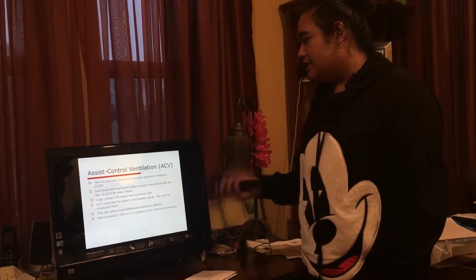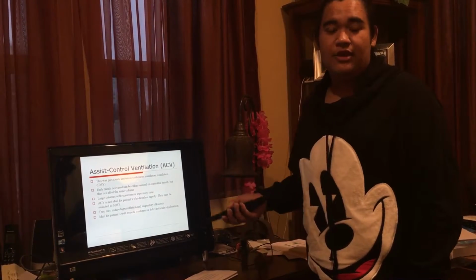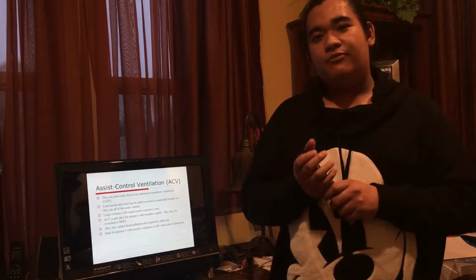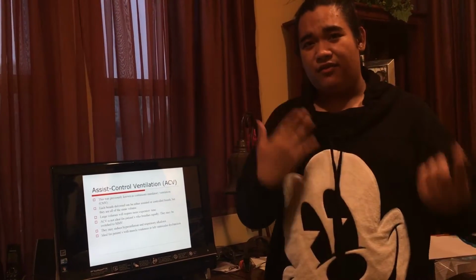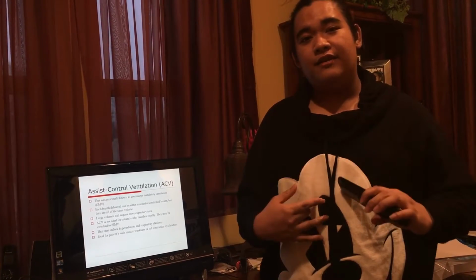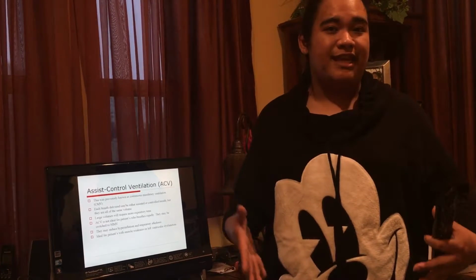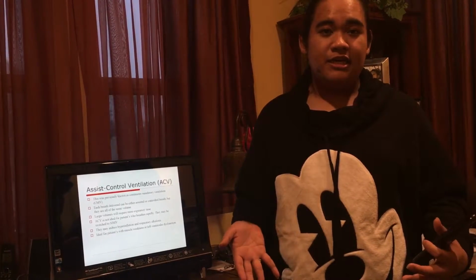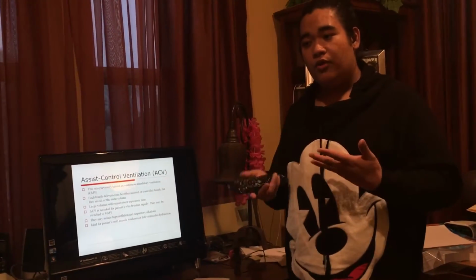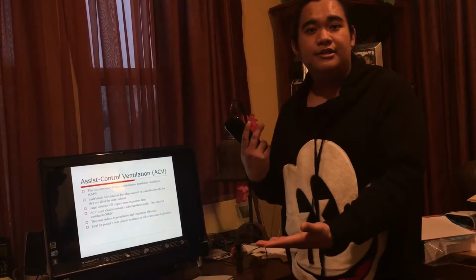If we're giving larger volumes, we need to have more expiratory time. Why is that? Because if we give larger volumes, a lot of the volume could remain or be retained in the lungs. That's why we need more expiratory time. That way, we know that whatever goes in could potentially come out.